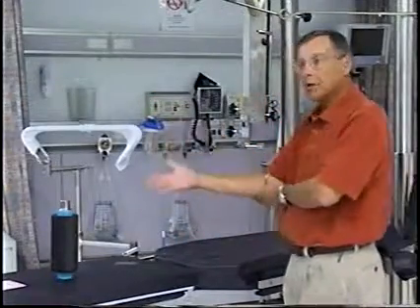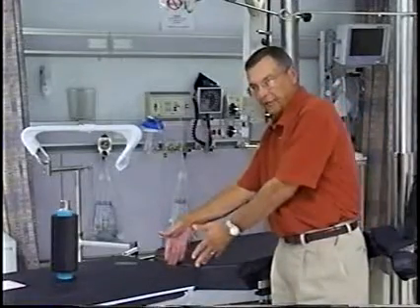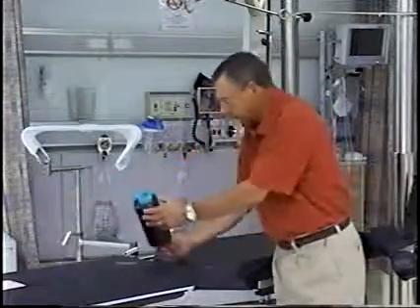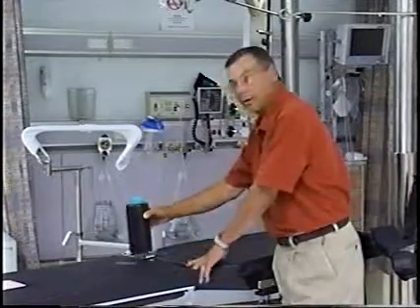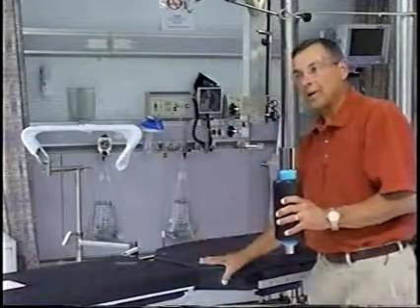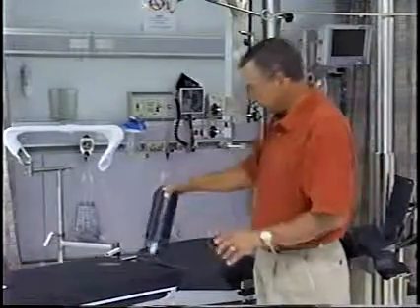So in your OR someplace, there's a device called a lateralizer or an offset device that will move this perineal post from here over to here, okay? Or from here over to here, depending on the hip. And that will throw the hip out a little bit further off the table. All right? So I'm sure you've got that here someplace.